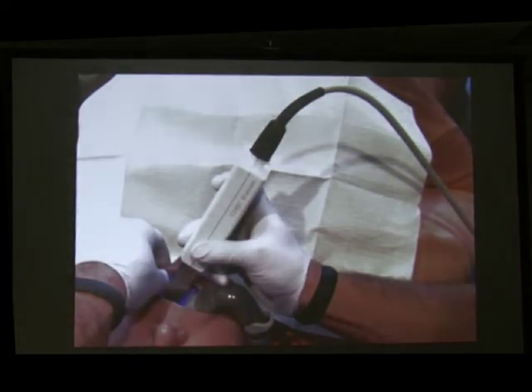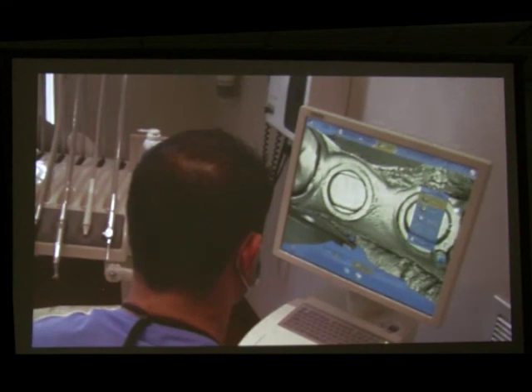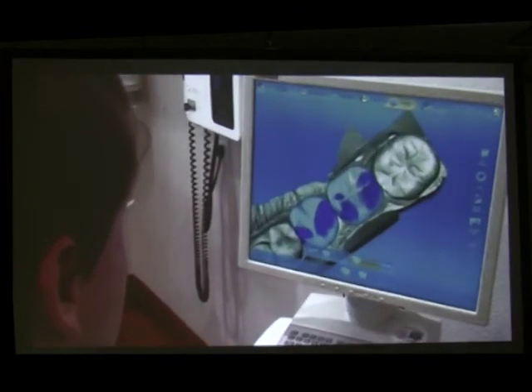CEREC: people that have CEREC and have to scan supragingival implants, look at what they see on their screen. It cannot get easier to scan a supragingival implant. So don't be afraid in posterior sites of leaving implants supragingival. Patients don't complain about white necks of teeth. Patients complain of yellow natural tooth roots.